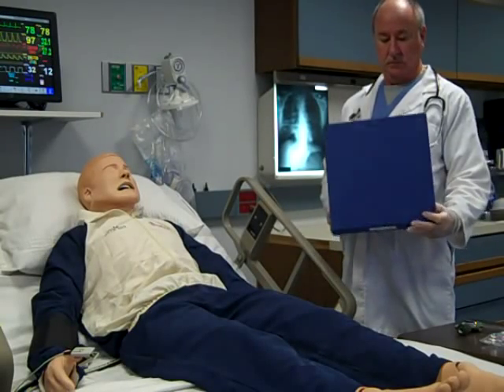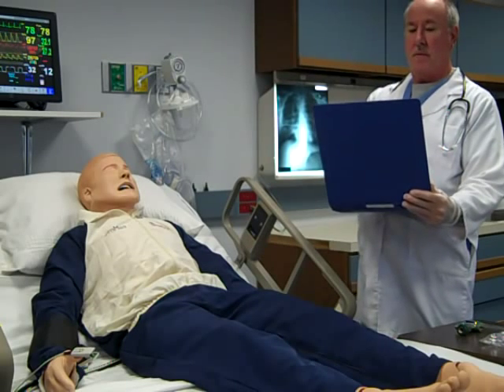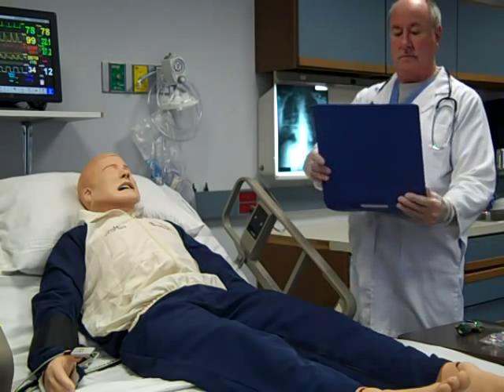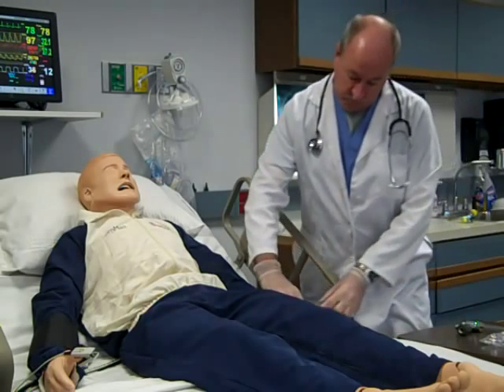Check the patient's chart for current physician's order. This should include method of delivery, FiO2, or titration oxygen percentage. Identify the patient using the patient armband.